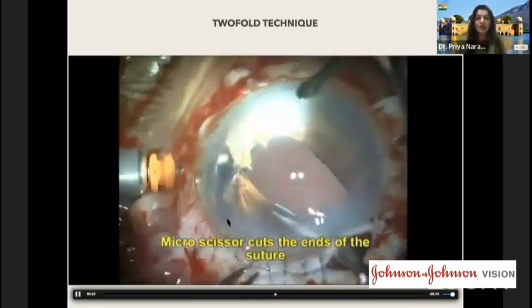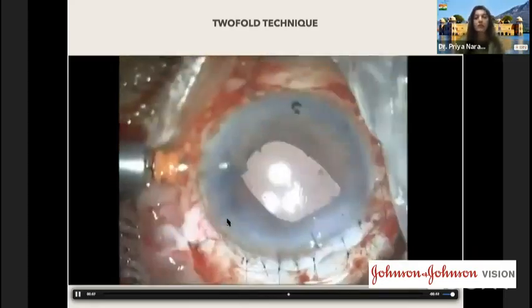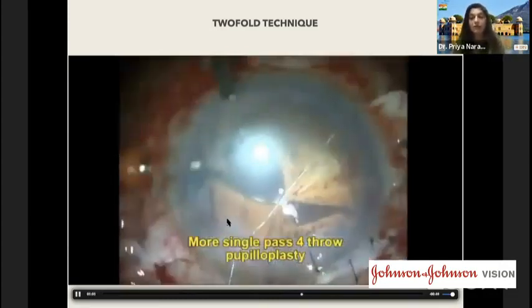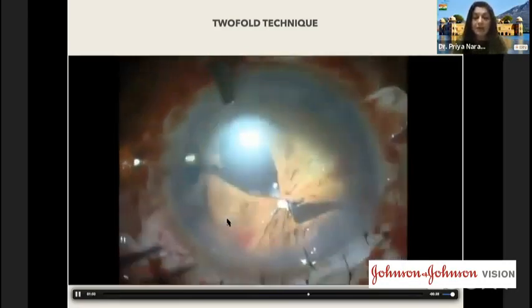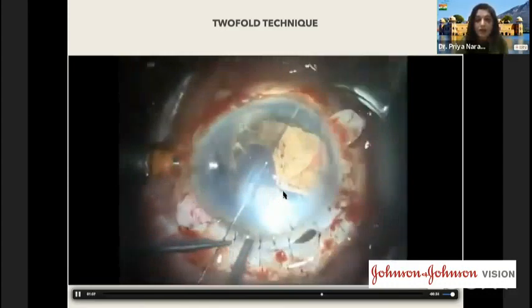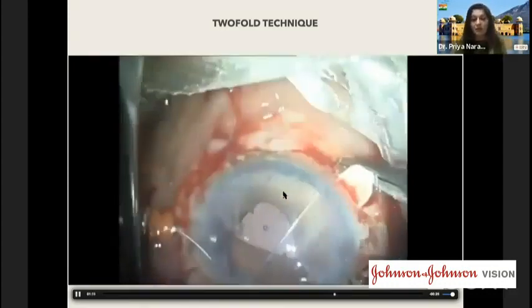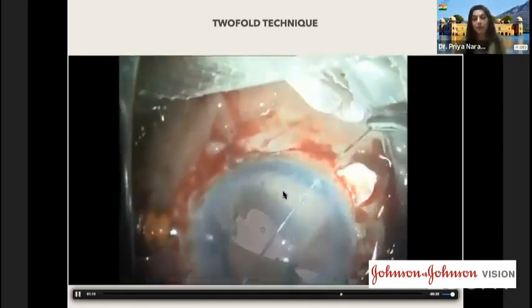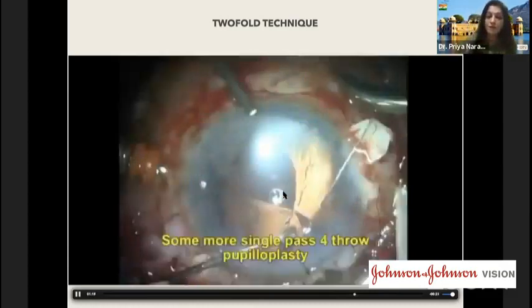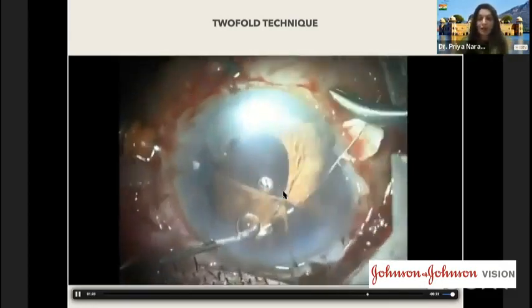Secondly, what is important is to do the surgical procedure under fluid infusion because these are complicated cases. You might even choose an OVD to do that. That's not an issue, but it all depends upon the kind of trauma that the patient has had at that point of time. So as you see here, continuous repair is going on. You're trying to reconstruct a functional pupil. It's not cosmetic, but it's a functional pupil that you're trying to create here, trying to give functionality of vision to the patient in the postoperative period. So that is the aim.